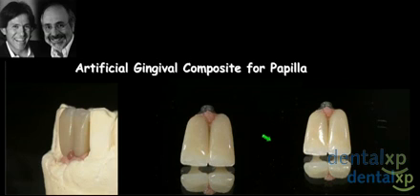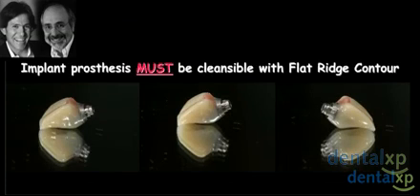We etch it exactly like the inside of your veneer cases. And then we add composite directly in the mouth onto the tooth. So it's a direct aspect. So you get a really nice, clean interface, and then you just smooth it off. And this is something that you'll see mentioned again tomorrow evening on the webinar with Christian Coachman that will be at the same time here, Eastern Time, 7 o'clock.